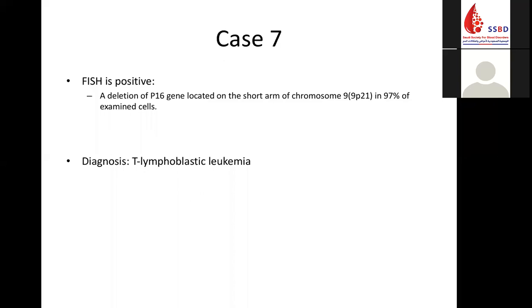If you remember, in that case of the B lymphoblastic leukemia, we saw the hand mirror, we saw the very aggressive morphology of the cells, so you may assume that that case may be a T cell. This one, you would think that, okay, this case could be a B cell, very fine blast, small. You wouldn't expect that this is a T, but nowadays patients are not textbooks anymore. So whatever you are used to describe your blast, there is always an exception.